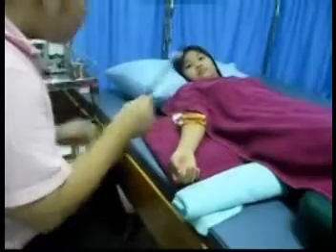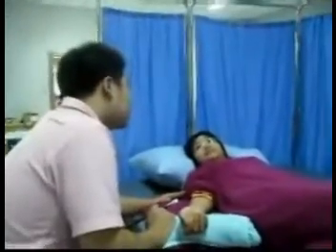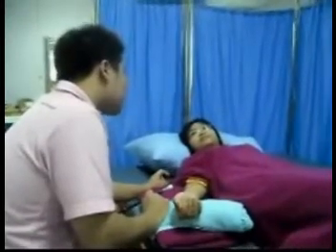Point electrode. Just a moment, I will release the electrical current to you. If you feel a pricking sensation, you can call me.